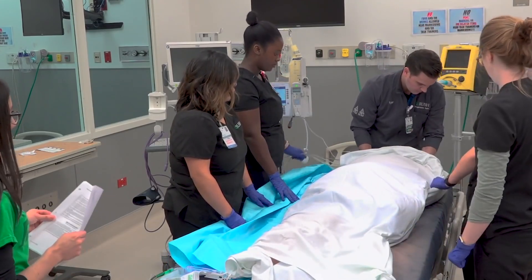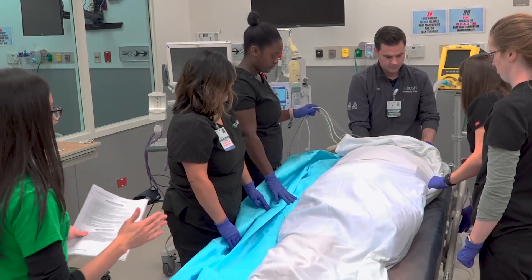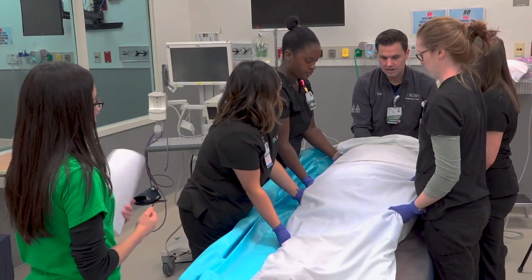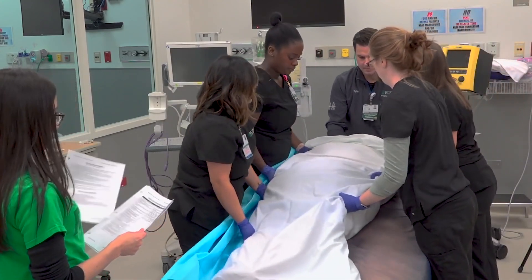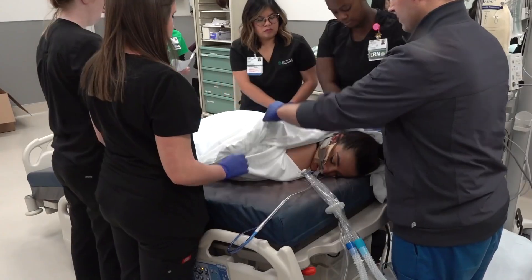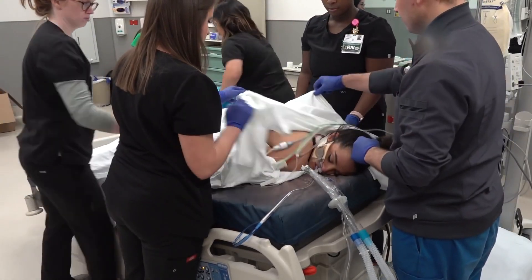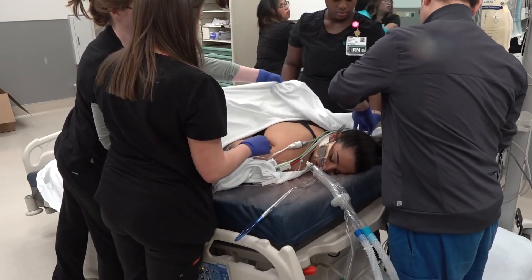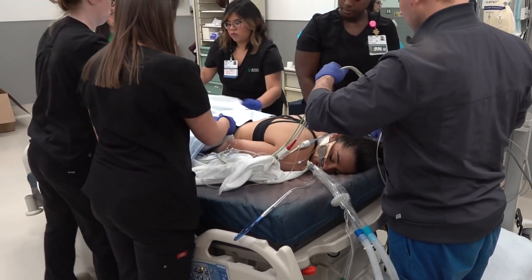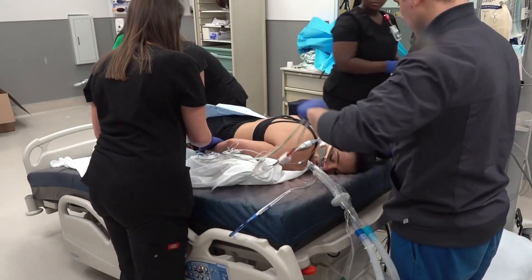We will now move on to phase three: care of the patient while prone. The bed will be placed in reverse Trendelenburg position, 10 to 20 degrees. If the patient needs to be repositioned more to center, on the RT's count of three, the patient will be moved. The maxi tube can now be removed along with the flat sheet. The EKG leads can be placed on the patient's back, and a wedge will be placed underneath the patient's shins to elevate the toes off the bed surface.